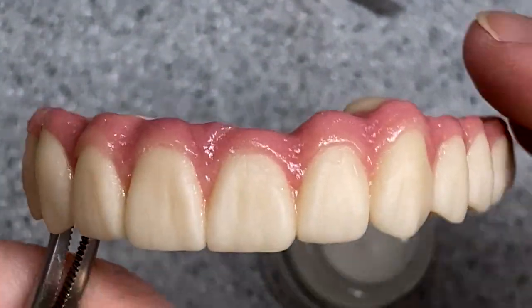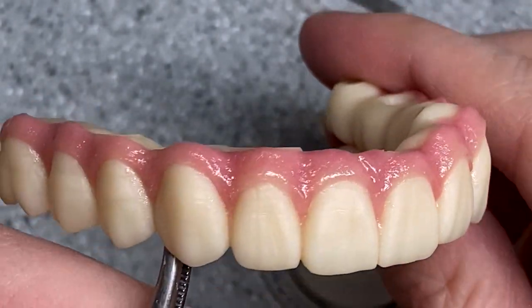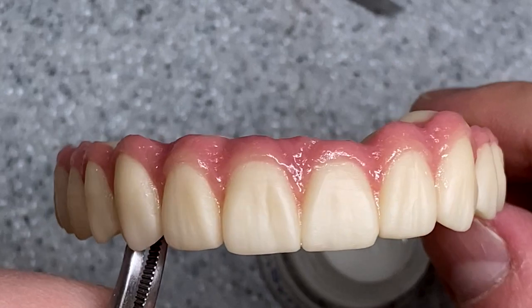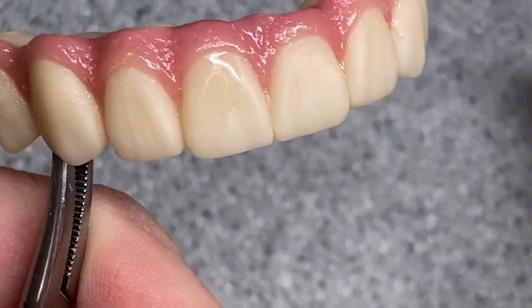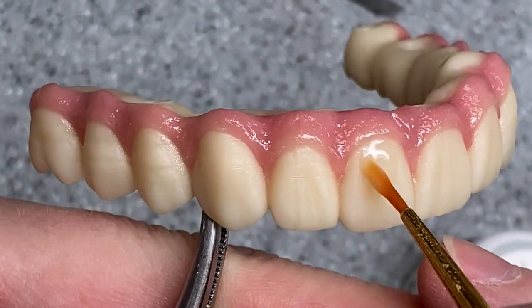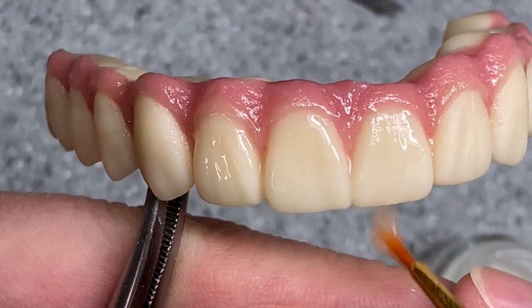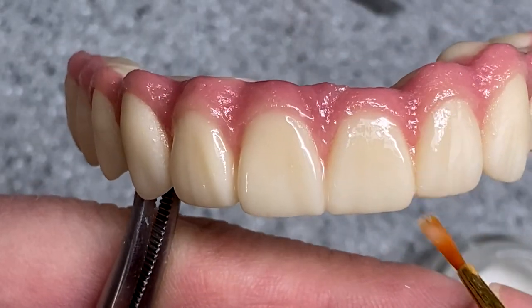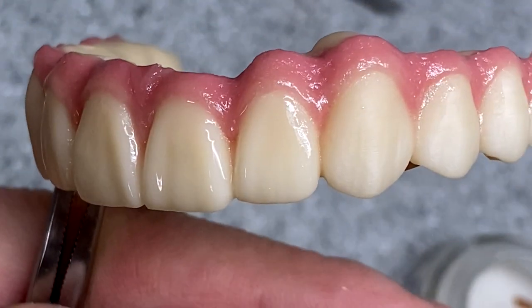Okay guys, look at this beautiful case — it came out and I think it looks very pretty. Let's glaze it. So I'm just gonna take this glaze first and I will apply it everywhere. It's a medium glaze — it's not too watery and not too thick.